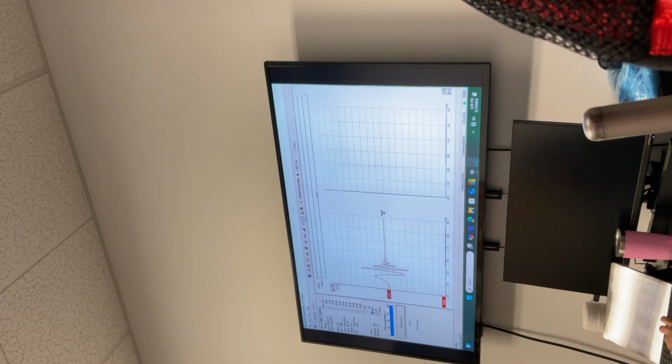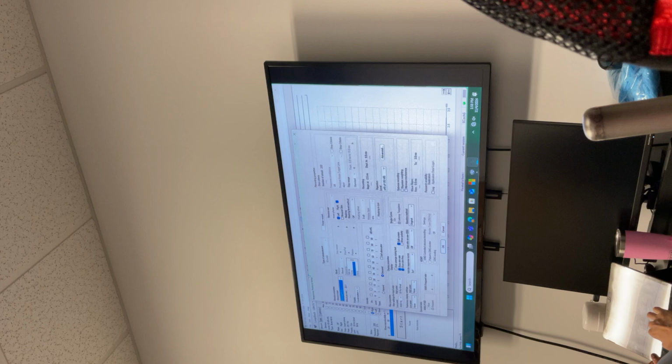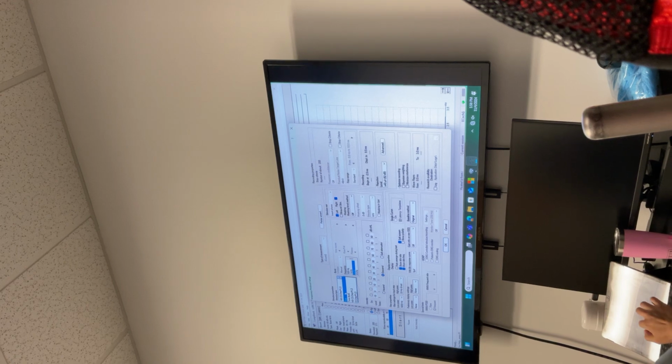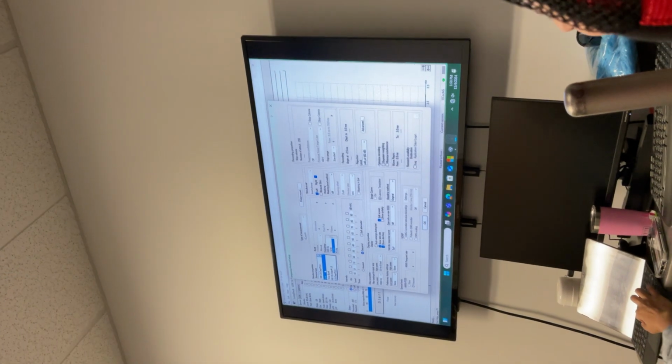So now let's go to narrowband. Before I go there, what frequency is click? Click is a stimulus by itself, it's broadband, but primarily a high frequency stimulus, like 1 to 4 kilohertz.